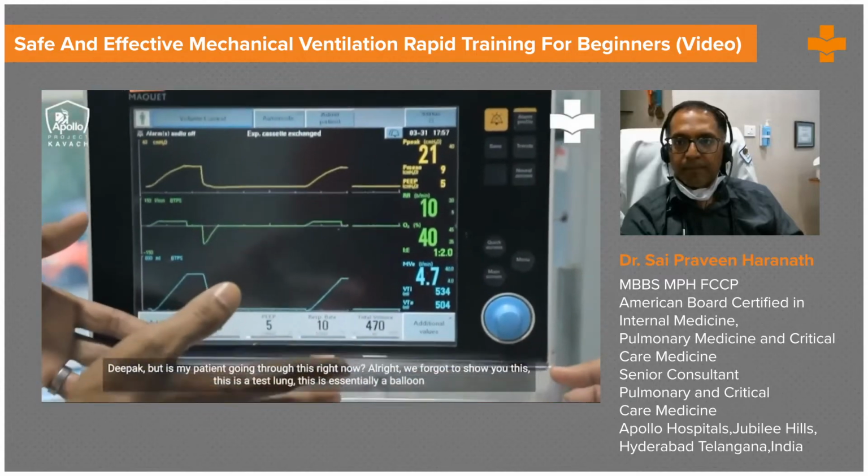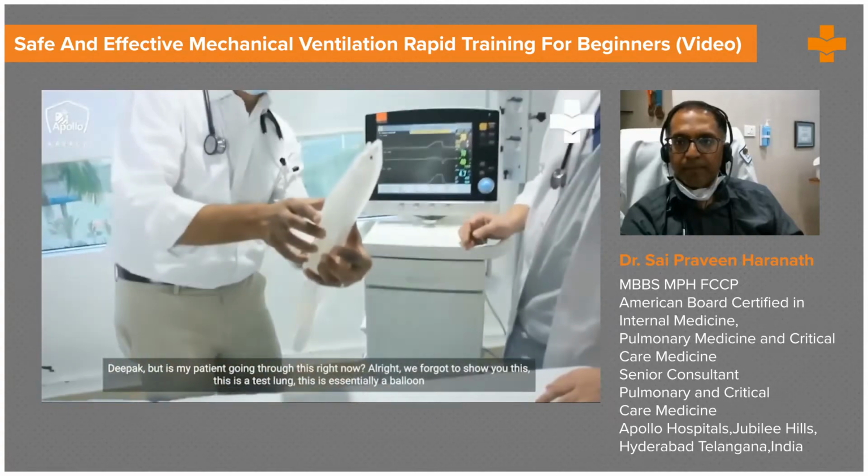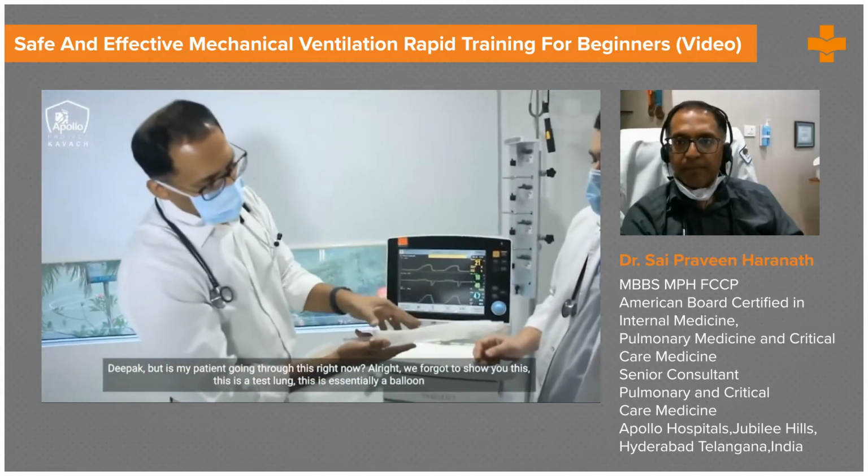Deepak, but is my patient going through this right now? No, we have a test lung. Oh, right, we forgot to show you this. This is a test lung. A test lung is essentially a balloon.